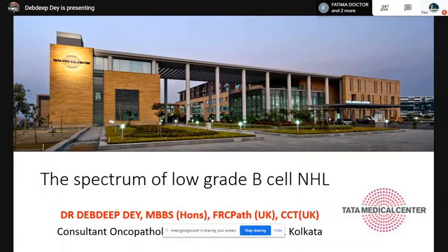Today I'm going to speak about the spectrum of low-grade B-cell NHL. Some time ago, I had given a lecture about approach to lymph node along with basics of immunohistochemistry. Today, we will discuss the various spectrum of low-grade B-cell non-Hodgkin lymphoma and what are the pitfalls and what are the things to be careful about when making a diagnosis of a low-grade B-cell NHL.